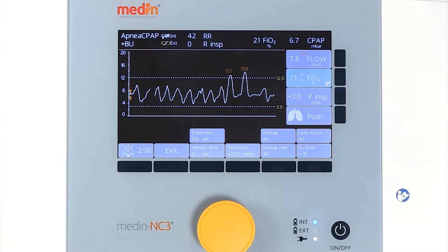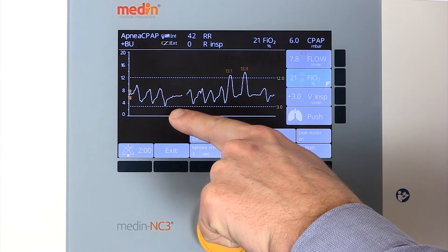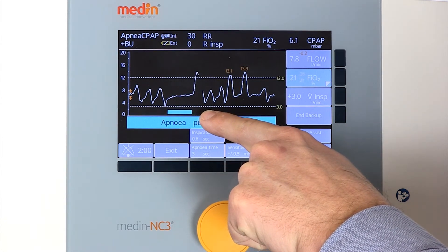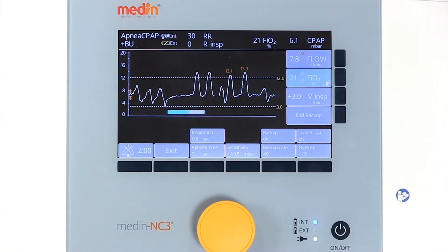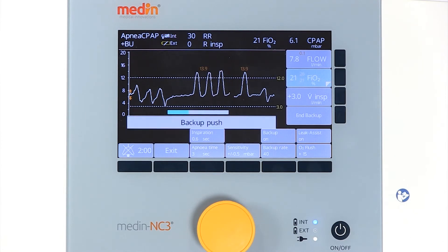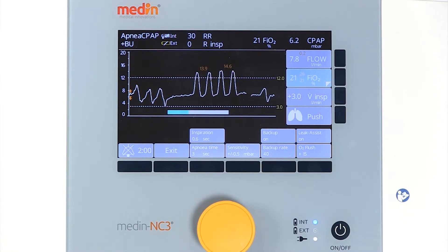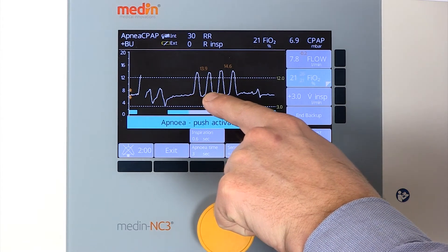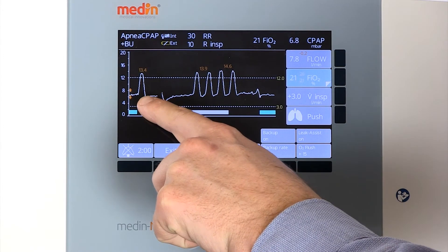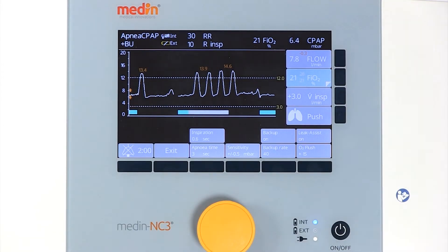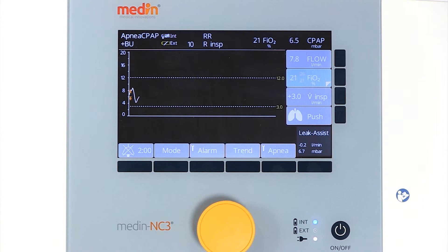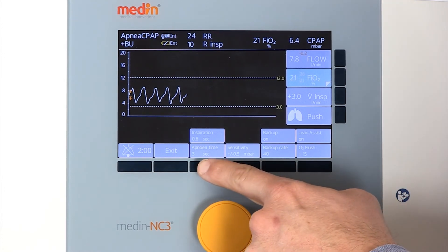In the case of apnea, which is indicated by a blue bar, the Medin NC3 either applies a single manual breath according to the apnea time, or an optional backup rate. The backup rate can be adjusted from 10 to 120 breaths per minute. The rate of the backup depends on the selected inspiratory time.